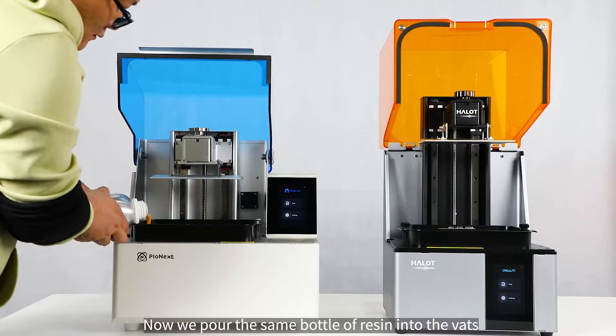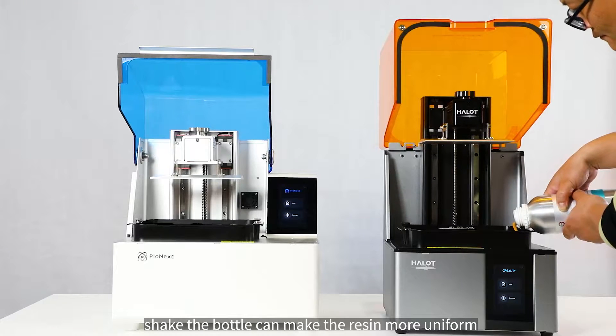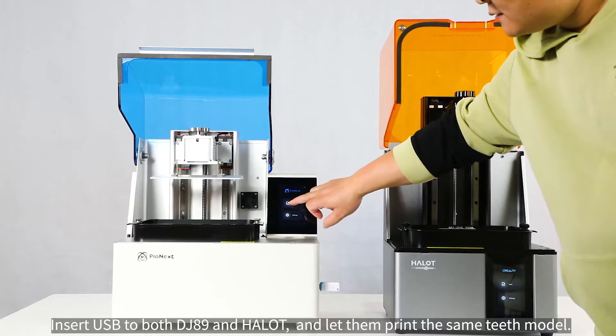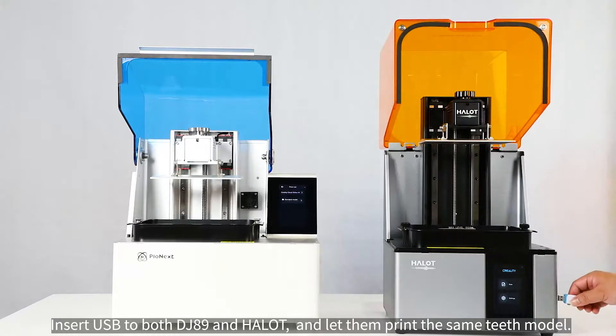Now we pour the same bottle of resin into the vats — shaking the bottle makes the resin more uniform. We insert a USB into both the DJ-89 and HALOT and let them print the same teeth model.